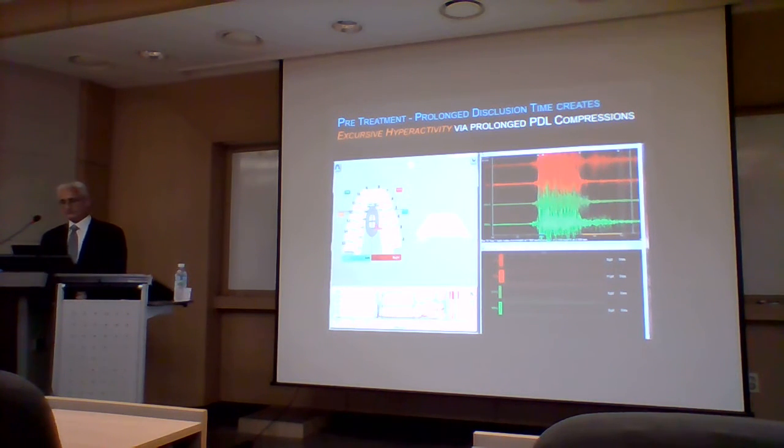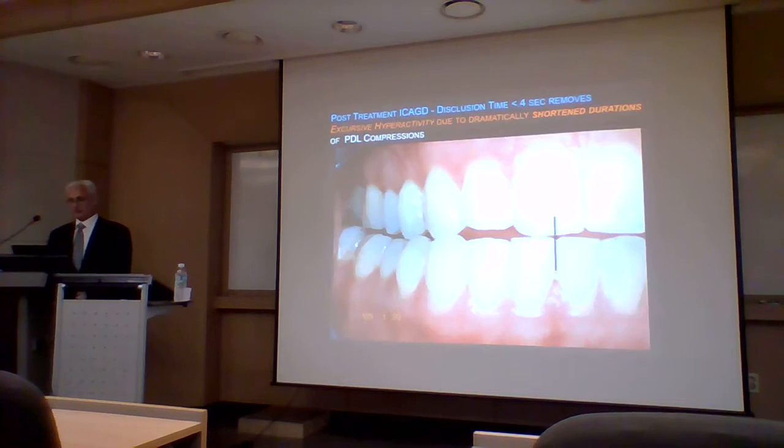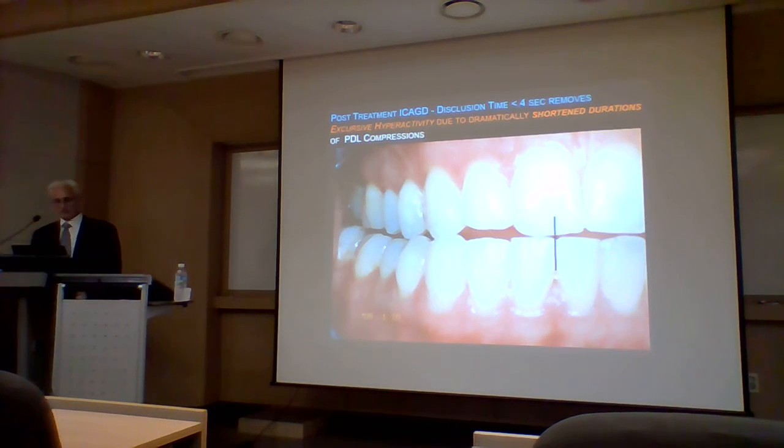아마 저분이 실제로 전방부에서 가이드가 일어날 때까지 거리가 굉장히 있는 분이다 보니까, 그게 실제로 발생할 때까지는 머슬 액티비티가 굉장히 오랜 기간 동안 남아있는 걸 볼 수 있어요. So then we can change that, rearrange that by changing the occlusal function.